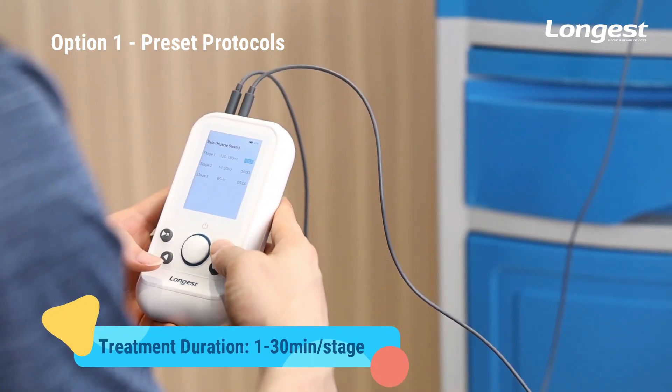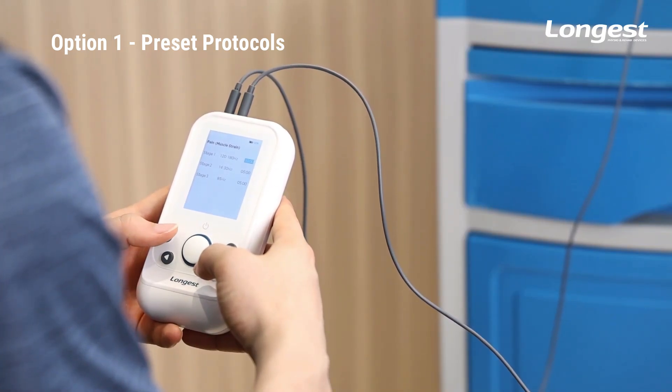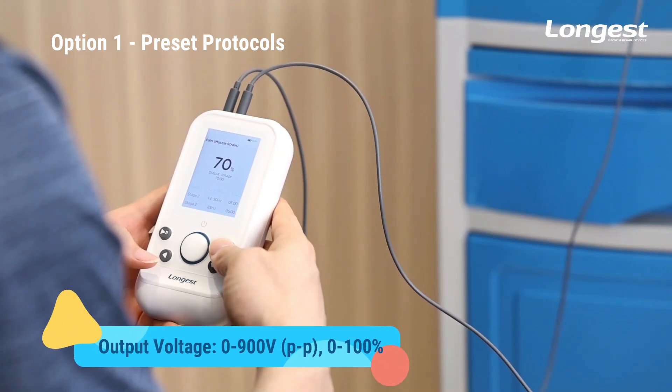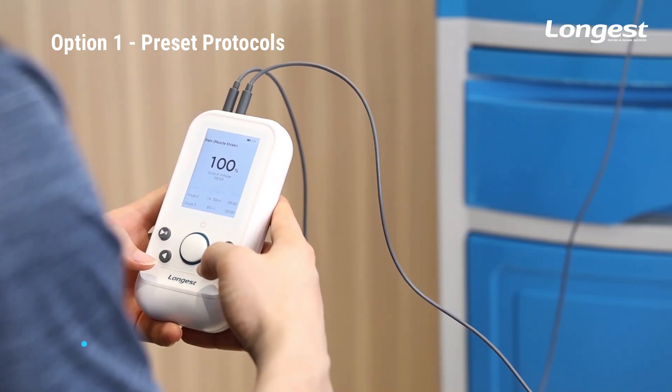In preset protocols, you can only adjust the duration of treatment. Then press the button to enter the treatment interface, where you can adjust the output voltage. Press the button to start the treatment.